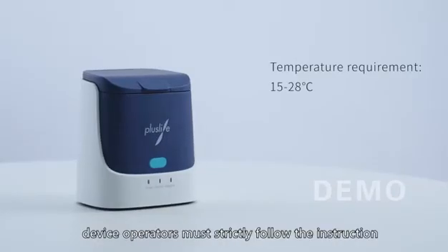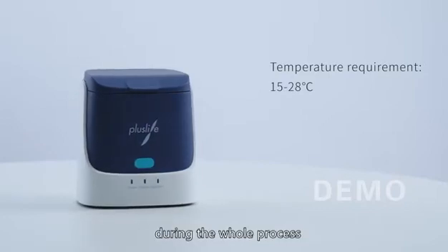Please be aware: device operators must strictly follow the instructions during the whole process.